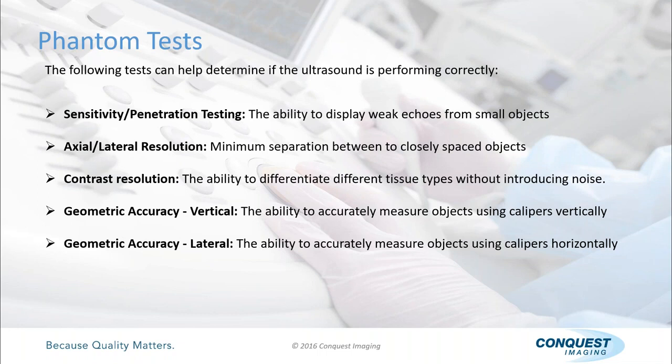Contrast resolution, I spend a lot of time on that. You only need to do contrast resolution with a single probe because frequency doesn't have an effect on the system's ability to determine density.